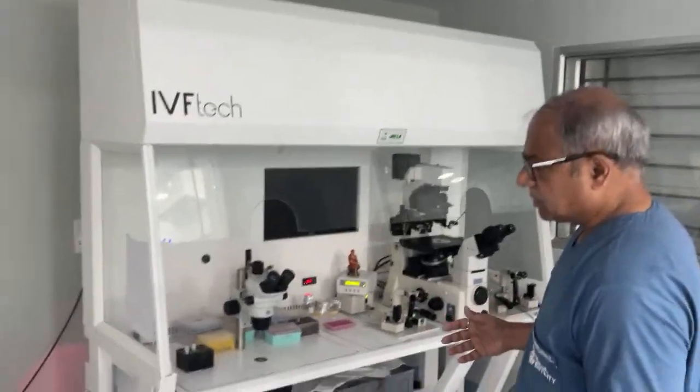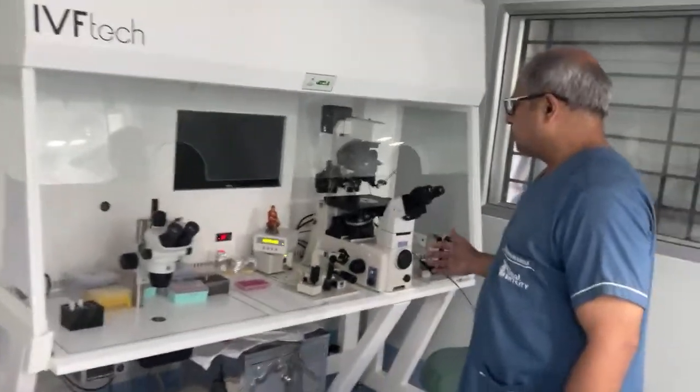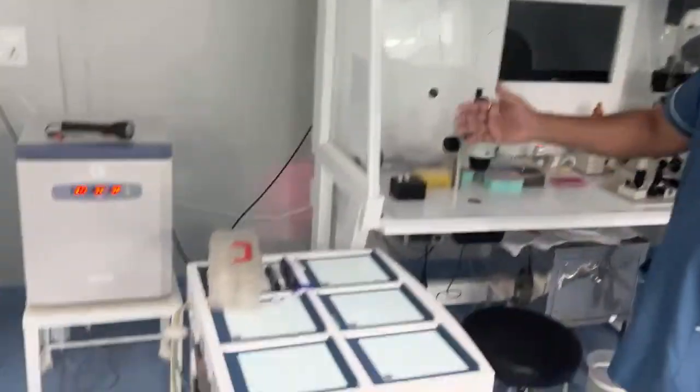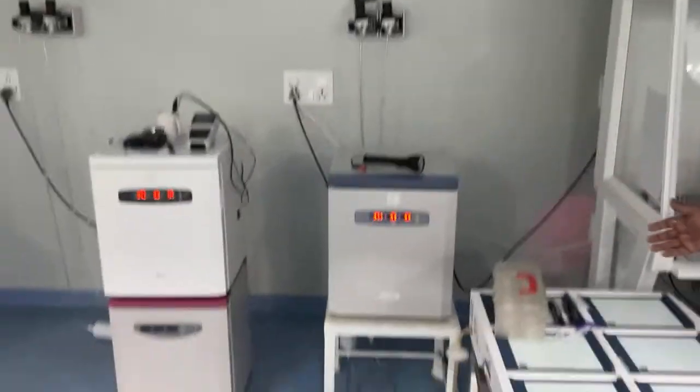This is our embryology lab, micromanipulation system, and we do embryo freezing. These are incubators which are actively being used.